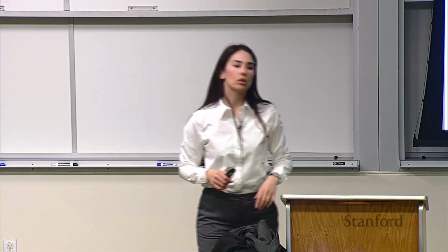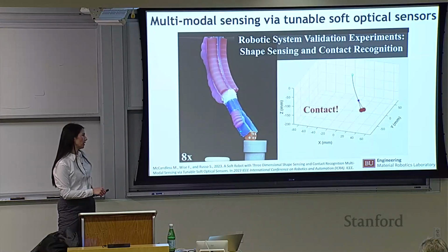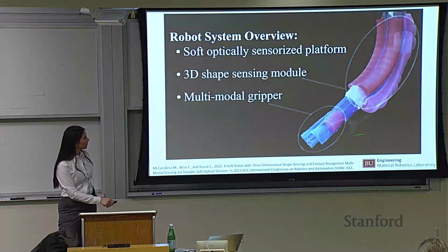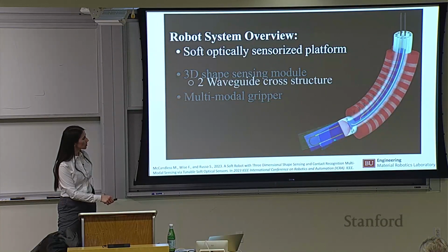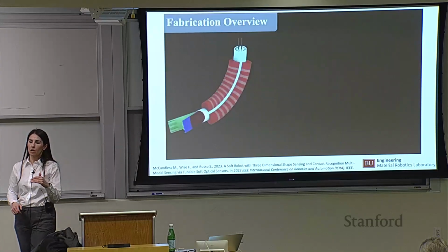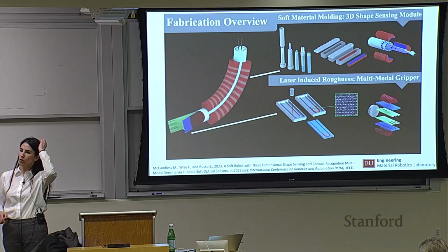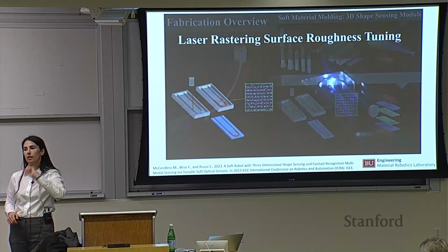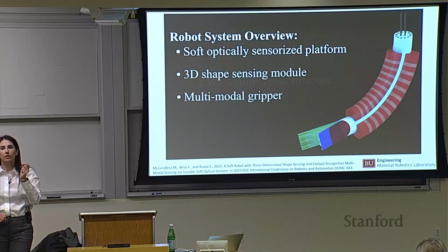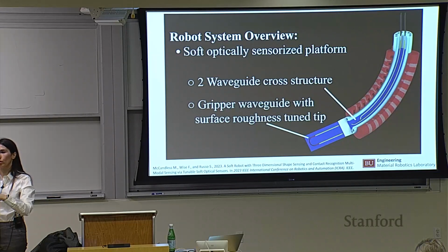Yes. So over here, as you can see, there's a little bit of light going through the waveguide, right? Here and here, there are optical sensors. The good thing about these optical sensors is that you can manufacture them, for example, with soft lithography and microfabrication techniques, and so you can scale them down. For a system like this one, I believe the diameter of our sensor was about 100 or 200 microns, but you can go even lower than that.